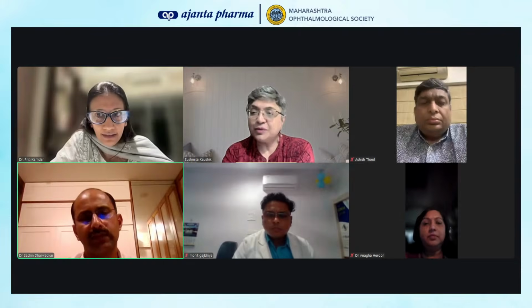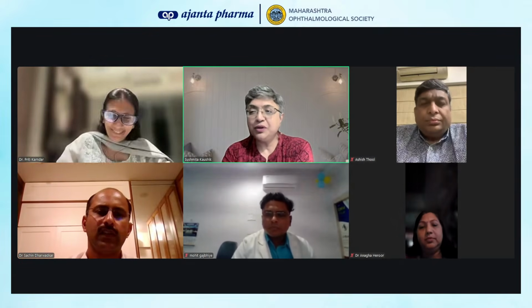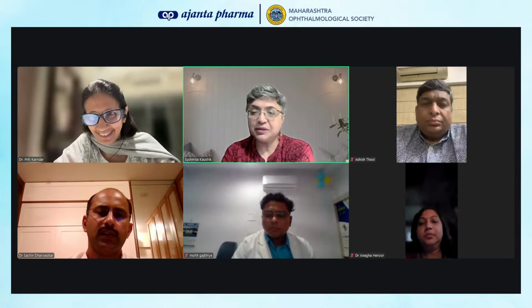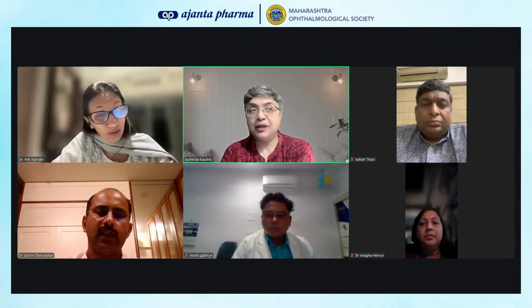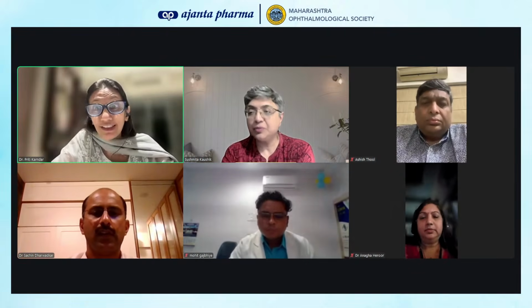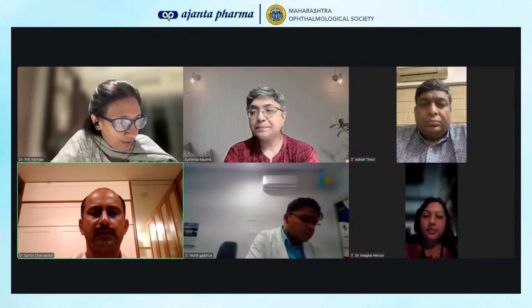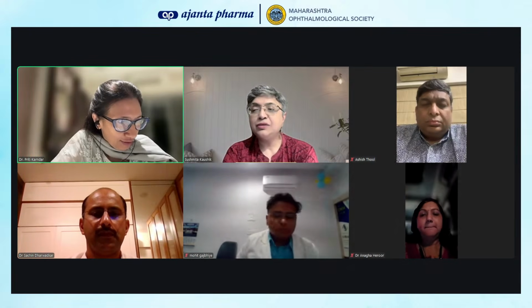Yes, correct. A glaucoma suspect is more important than a glaucoma patient. I would be okay doing only visual fields in a glaucoma patient, but it's the suspects where the OCT change would likely come up before the field defect comes. So I will do it more. Absolutely, 100%.